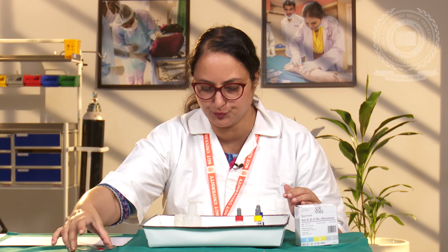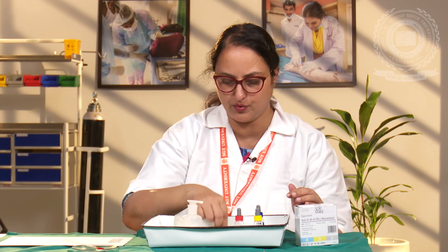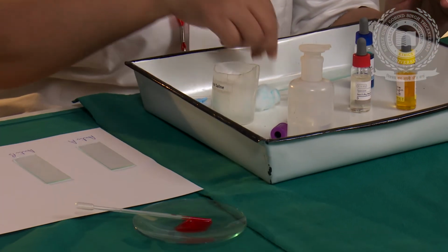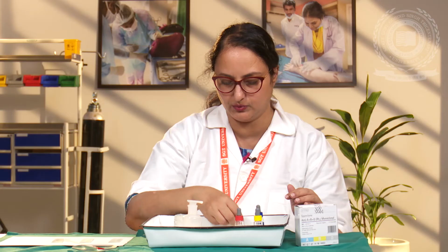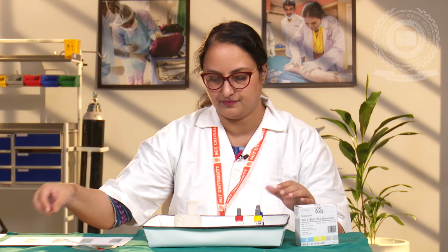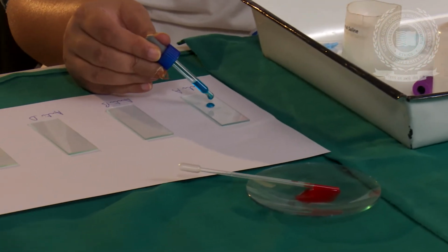Next, we proceed to put 4 glass slides on a clean sheet of paper under which I have written anti-A, anti-B, anti-D and control. Then we put the respective antisera on each slide like this.